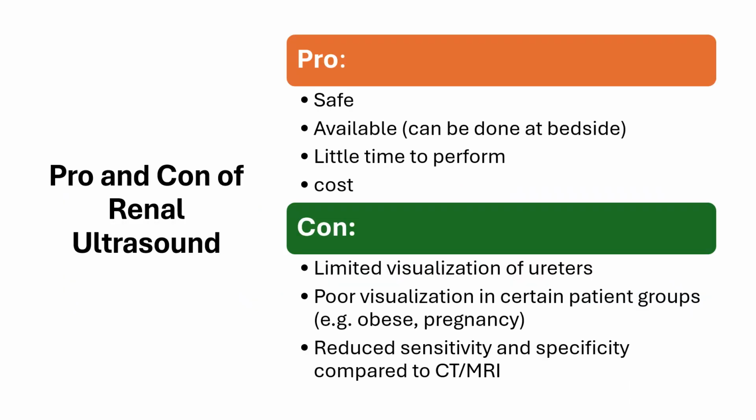So let's review some of the pros and cons of kidney point-of-care ultrasound. In favor of it is that it's a safe technique. It is readily available and can be done at bedside. It usually takes little time to perform and train, and also has relatively low cost.